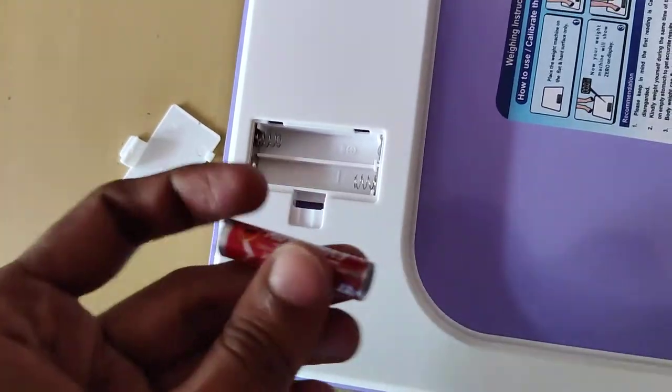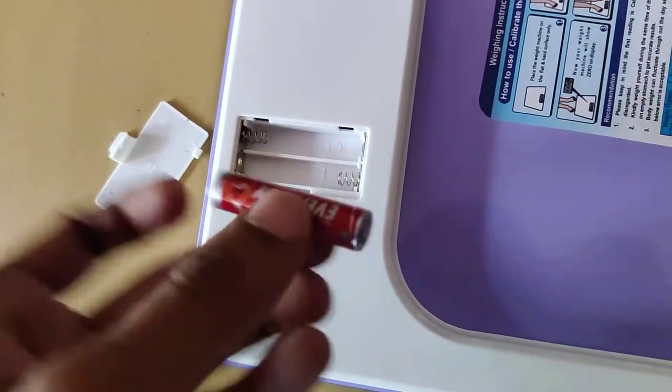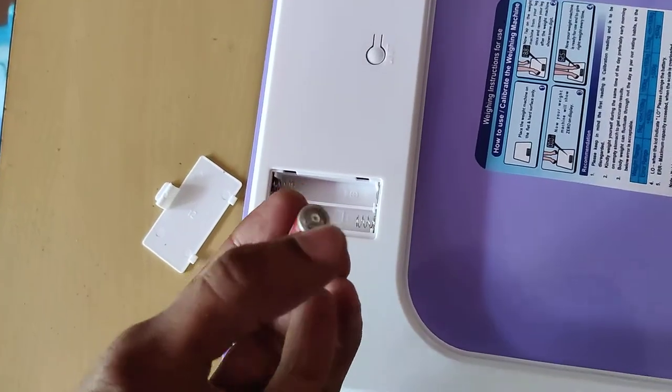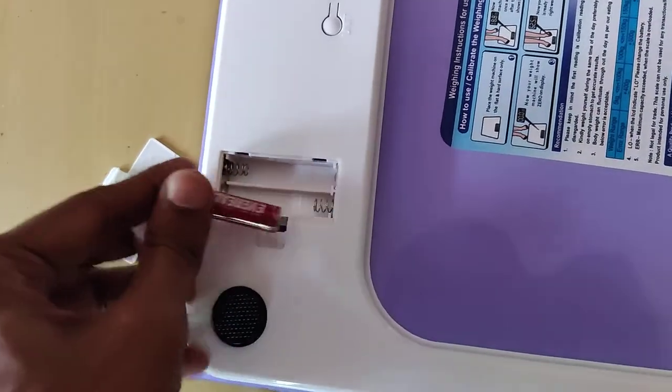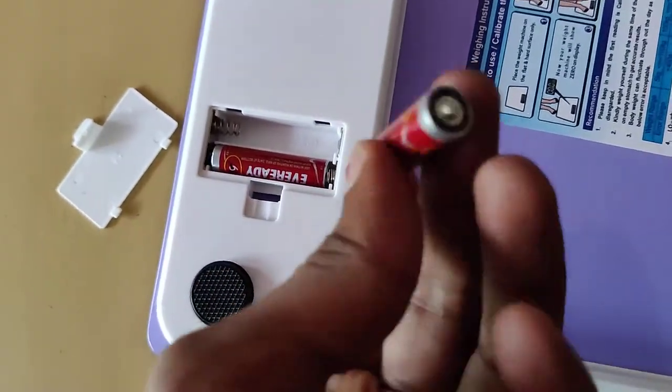The positive side should touch here and the negative side should touch here. I will show you how to insert. I'm going to insert with the negative side touching the spring inside — one battery like this. Now I take my second battery.